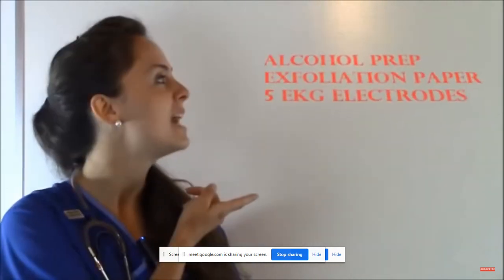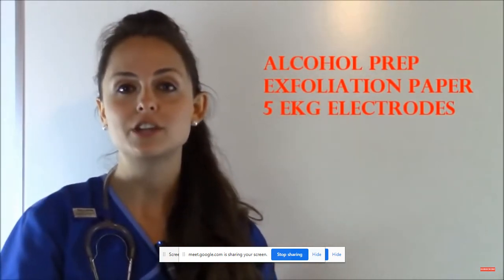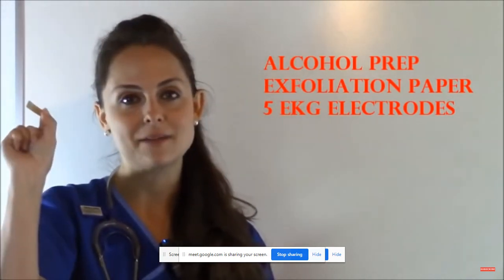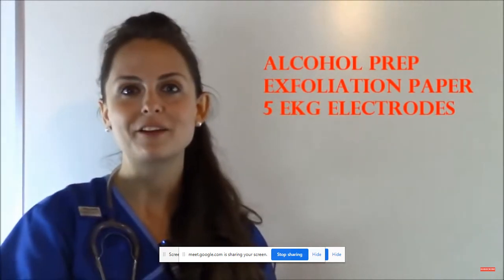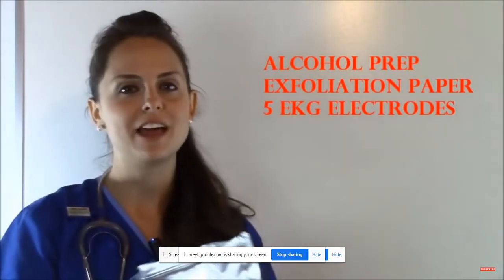So this is the supplies you will need in order to prep the chest. You will need some alcohol prep, which will just remove any oils or dirt from the skin. You'll need some exfoliation paper. I call it sandpaper. It just roughs up the top layer of the skin so you get a good connection with your electrode. And then you'll need a packet of electrodes.